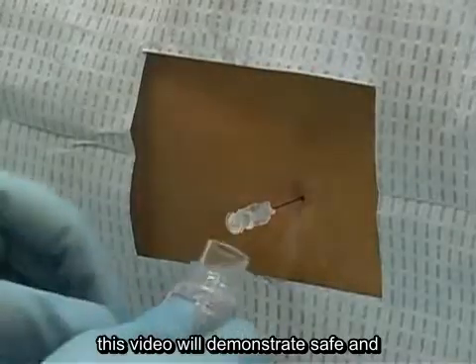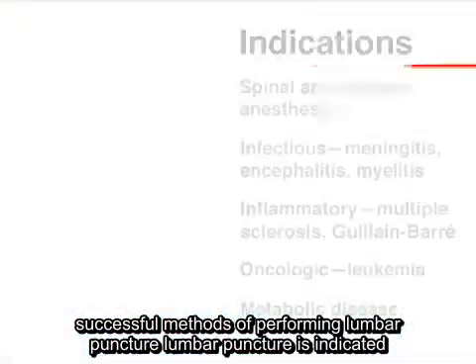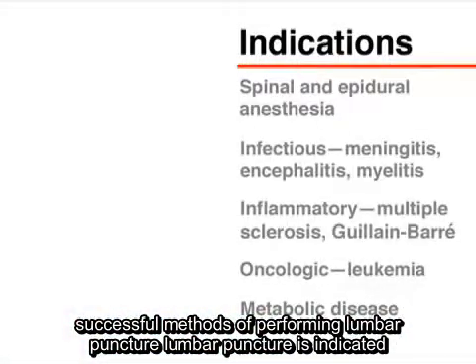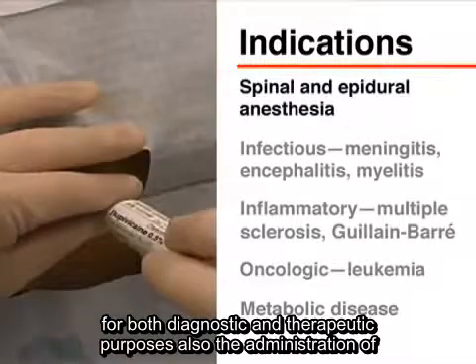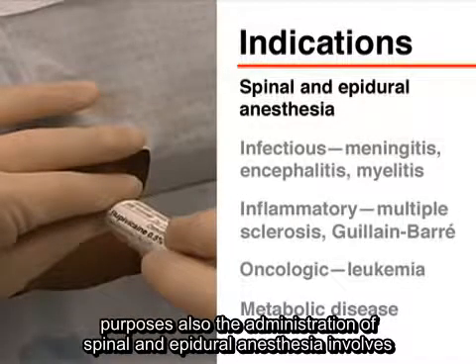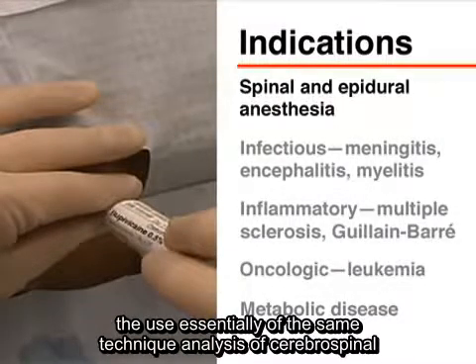This video will demonstrate safe and successful methods of performing lumbar puncture. Lumbar puncture is indicated for both diagnostic and therapeutic purposes. Also, the administration of spinal and epidural anesthesia involves the use, essentially, of this same technique.